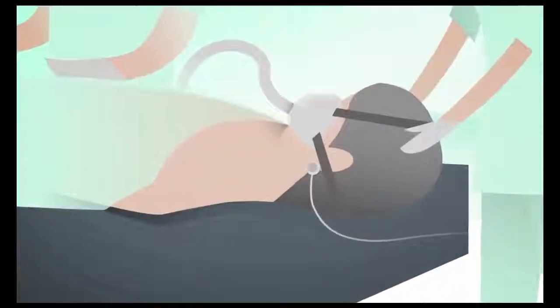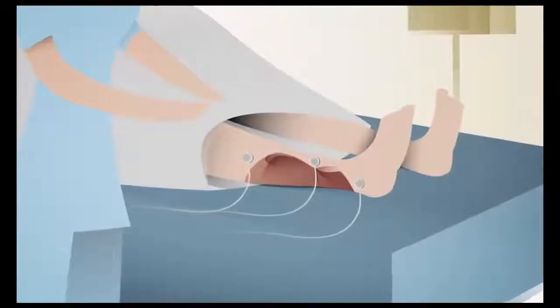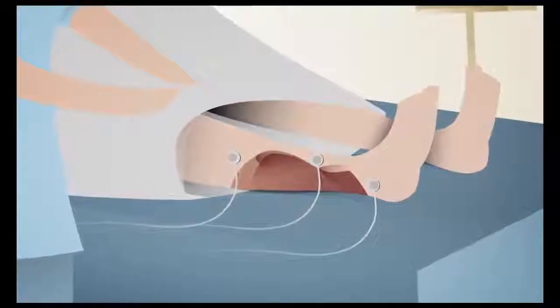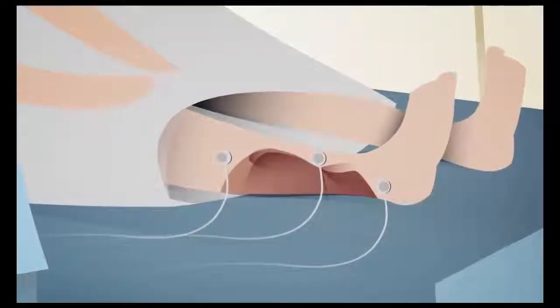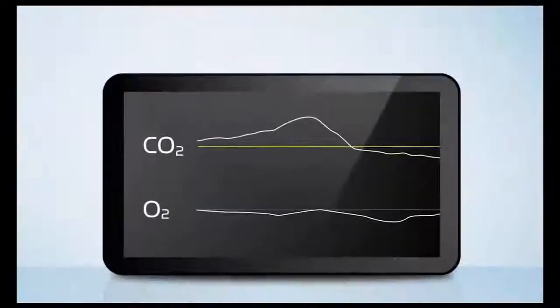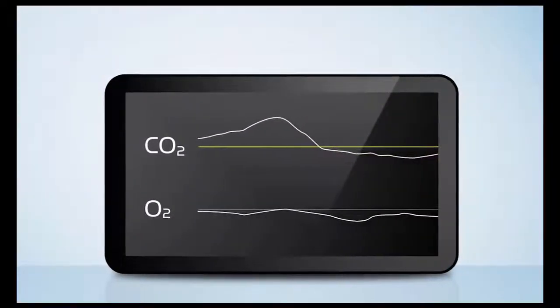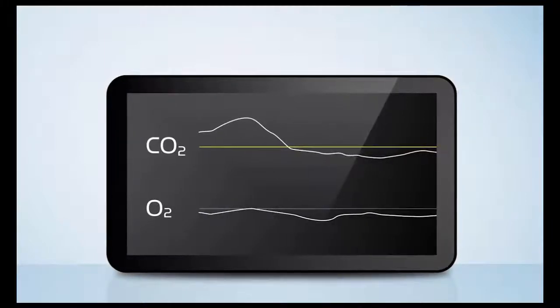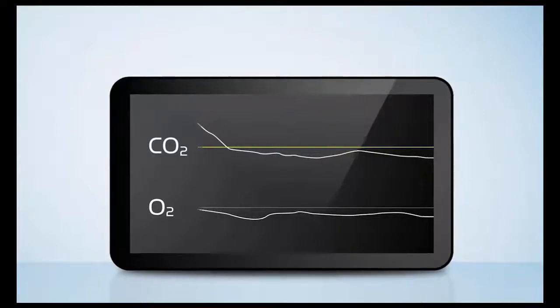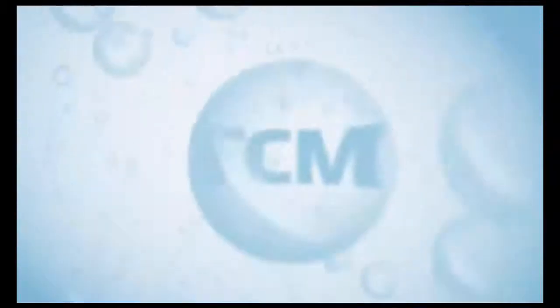During anesthesia, transcutaneous monitoring continuously keeps track of carbon dioxide levels to avoid complications in sedated patients. For patients with severe wounds, transcutaneous monitoring is used to assess healing probability, adequate amputation level, and treatment effectiveness. Transcutaneous monitoring provides continuous and non-invasive monitoring of blood gases and offers proactive rather than reactive intervention to critical changes.